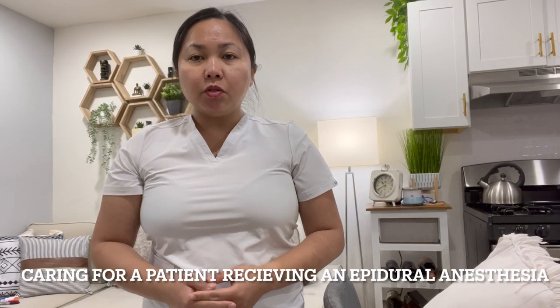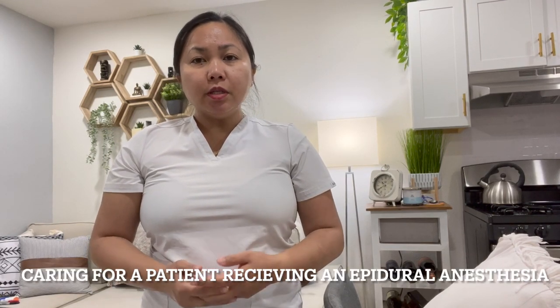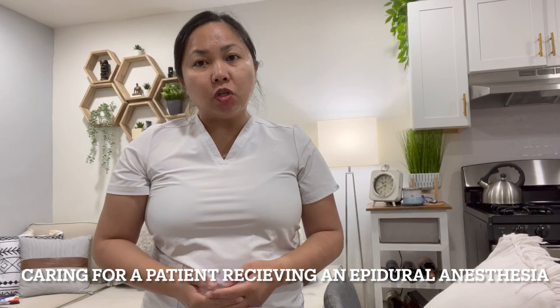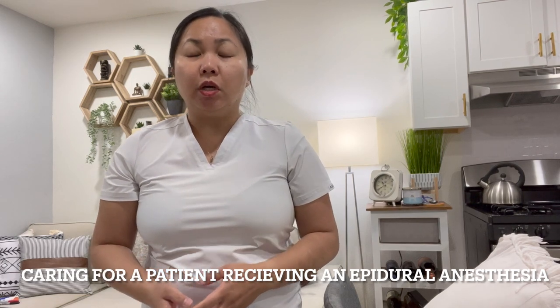Hello, my name is Jara and today I'll be performing a nursing skill called caring for a patient receiving epidural anesthesia. For this kind of procedure, I would gather my equipment.